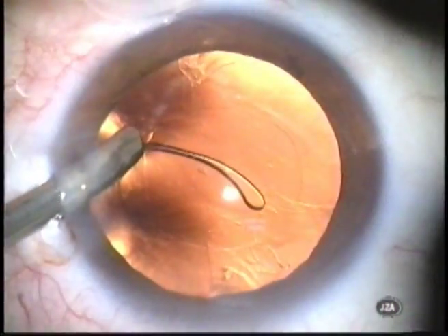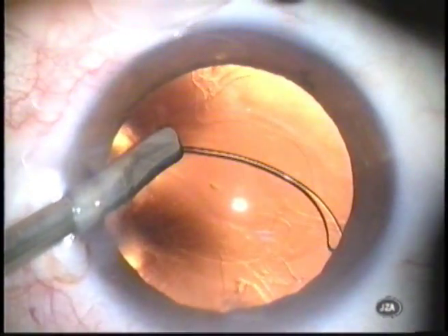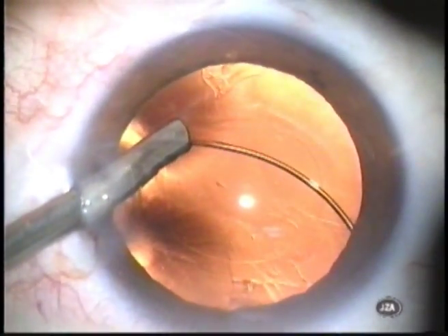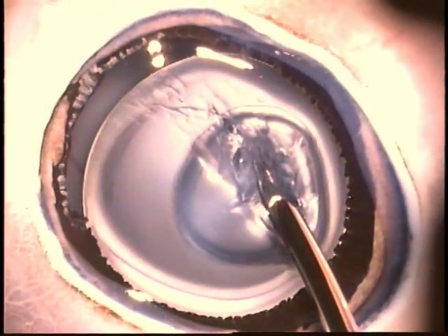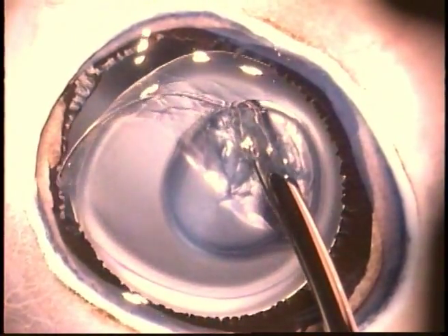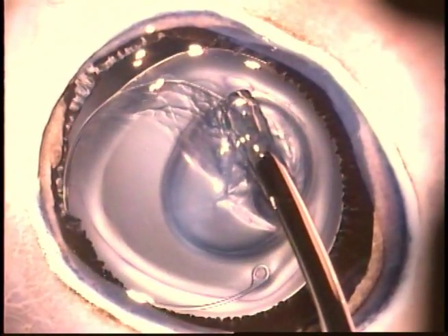During ring insertion, it would be desirable to eliminate the single point focal contact between the leading portion of the ring and the capsule periphery. It would also be desirable to eliminate the sliding of the ring around the capsule equator into position. With these purposes in mind, we developed a novel endocapsular tension ring concept that can totally eliminate these unwanted steps during ring insertion.